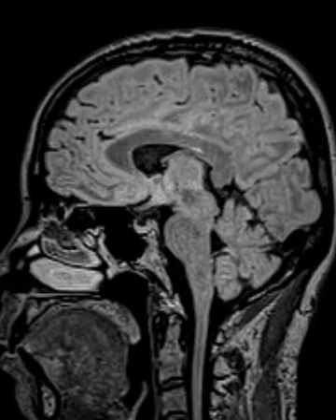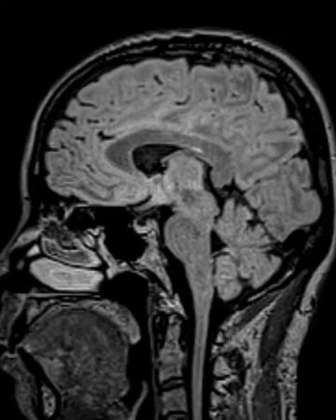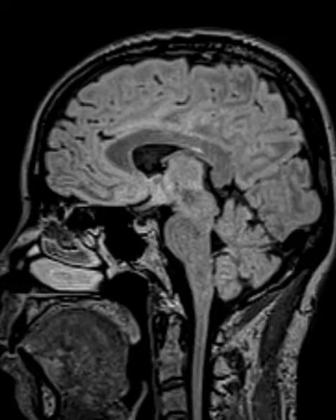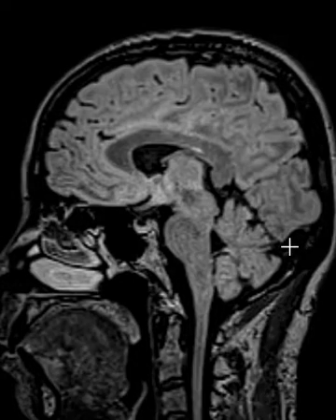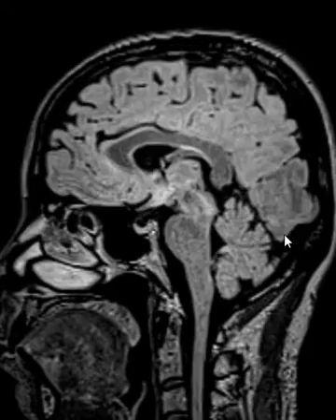Hello, this is Dr. Gay from First Look MRI, and this is a patient who was born in the 1970s who had severe headaches and they came in for an MRI of the brain to see what was going on.